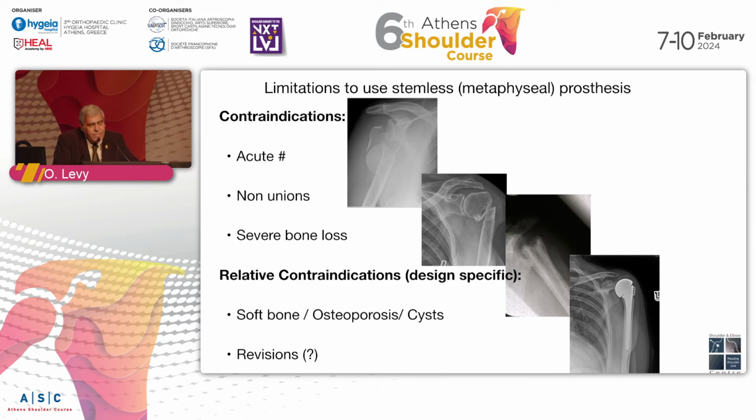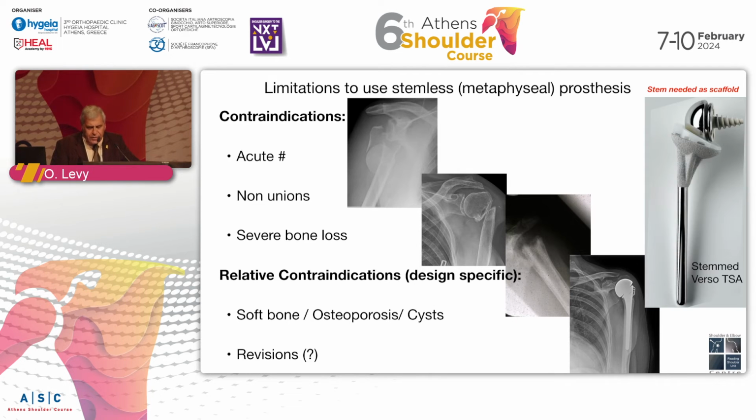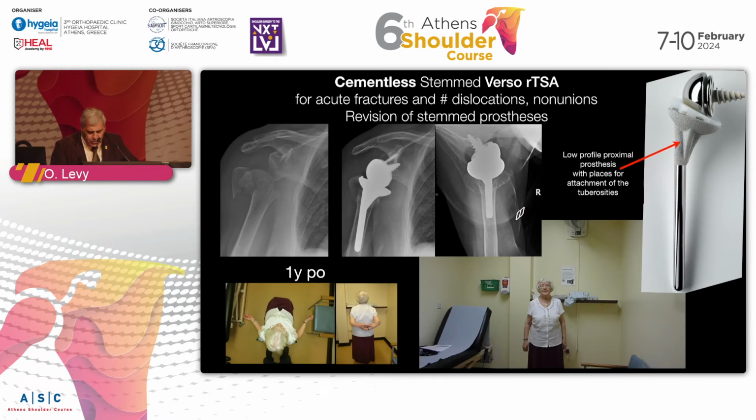However, there are limitations to stemless implants, and you must have a stemmed implant in cases of acute fracture, non-union, severe bone loss, or revision where someone else has been there with a very long stem and not a lot of bone left for you to revise. And for that, you need a stem as a scaffold.